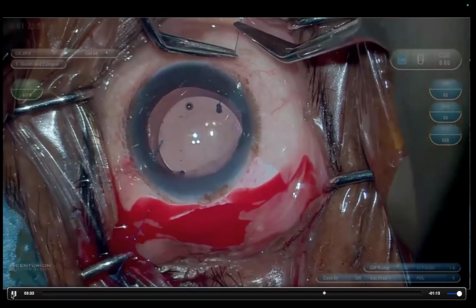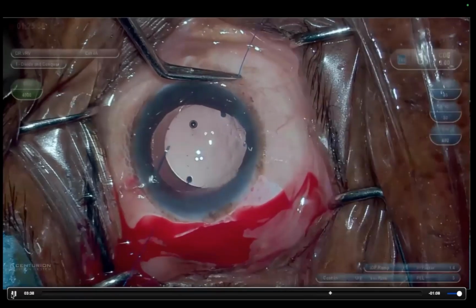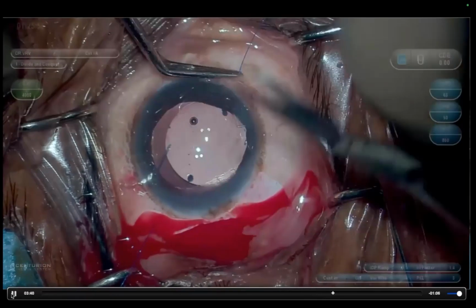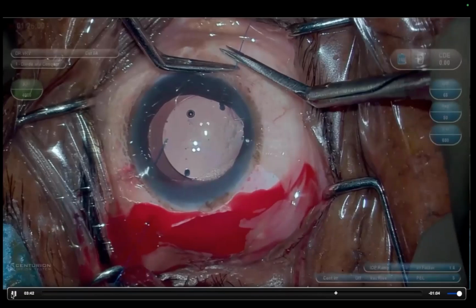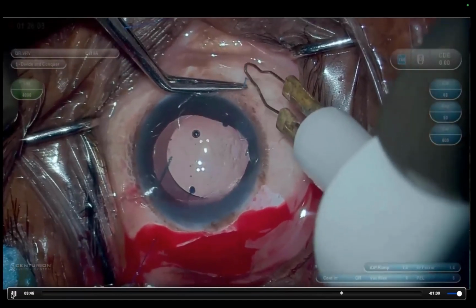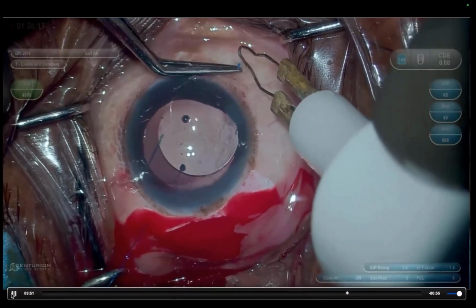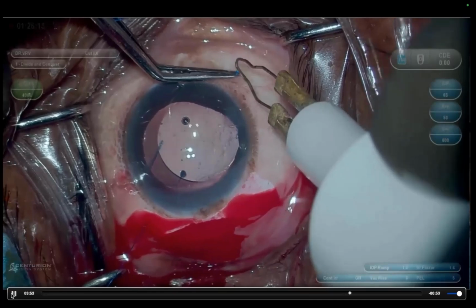So now once the flanges are engaged below the dialing hole, a mild decentration is created on the transconjunctival side. So always flange the transconjunctival side first because that is easier to bury in the beginning. So 1 mm of suture is trimmed, a flange is created. The mild decentration is to compensate for the thickness of the McPherson's forceps holding the suture.